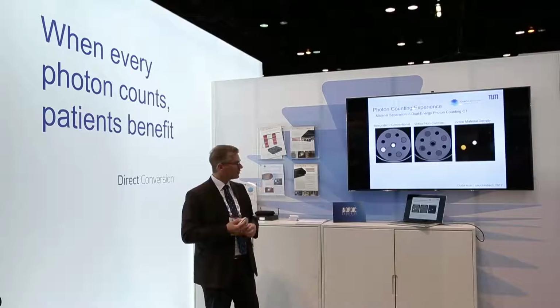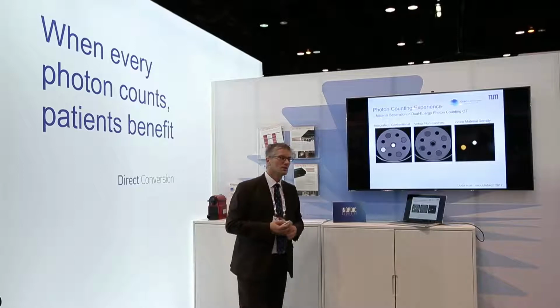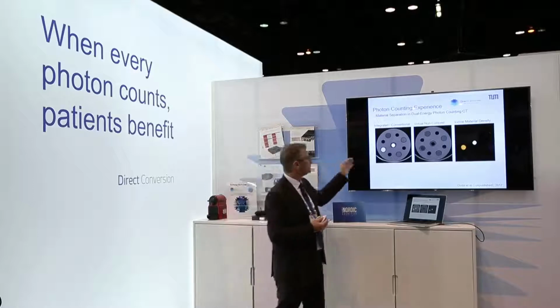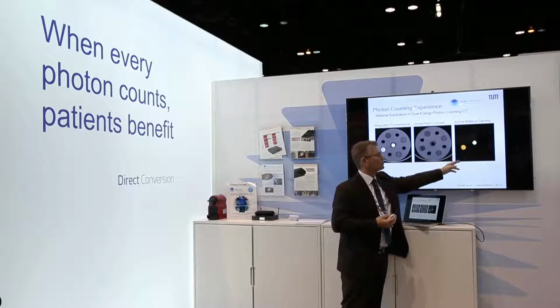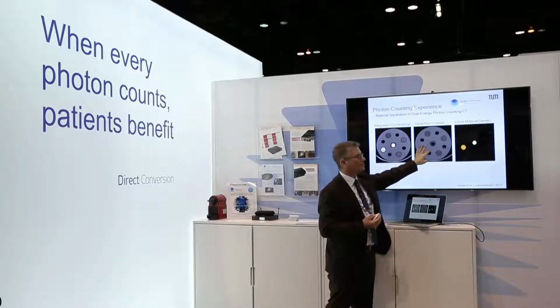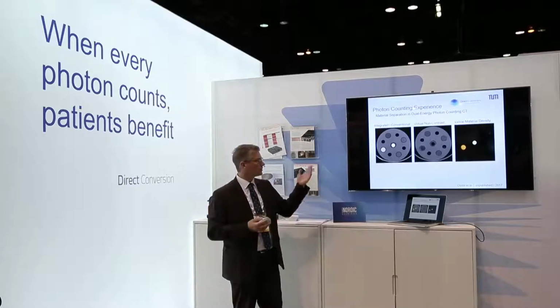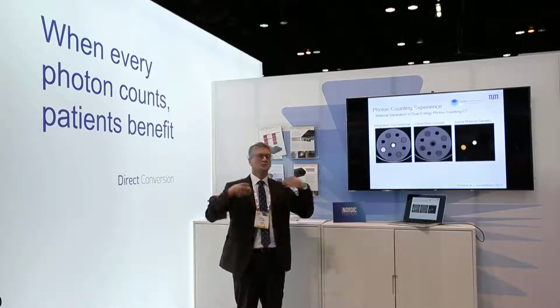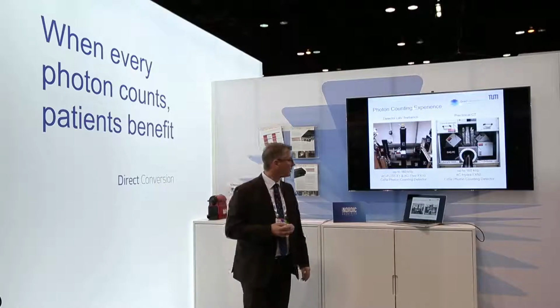So, of course, we first demonstrated on phantom samples that all that what I've been telling you for the material separation works. For example, it's a little phantom here. It's the integrated conventional scan, and this can be separated into the iodine material density. So these two vials actually contain iodine, and this is the virtual non-contrast, so separated after photo-Compton material separation into iodine density and virtual non-contrast. So this is just reproducing the photon counting results as what you have today in clinical use.